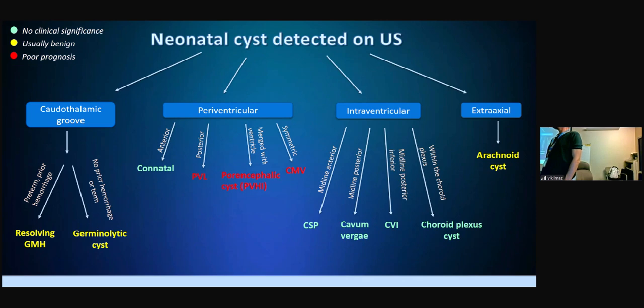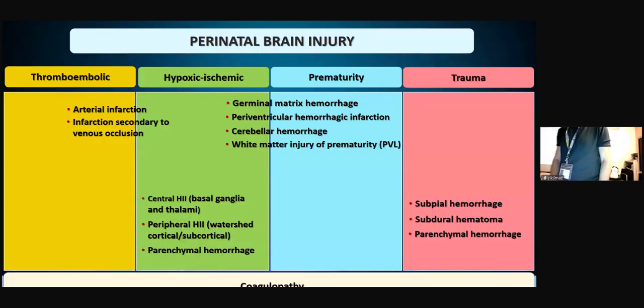Shall we start? Okay. So the second part of the lecture will be on hemorrhage.